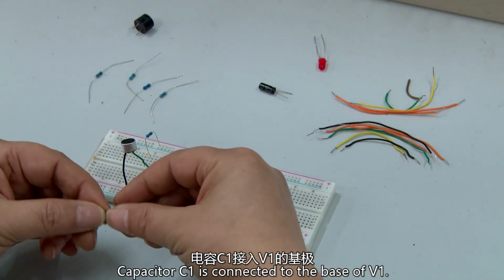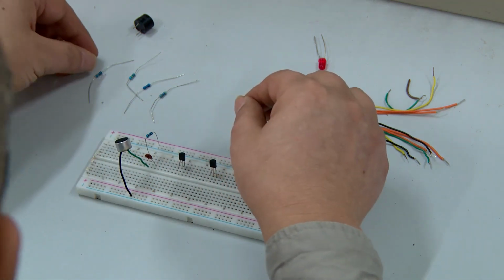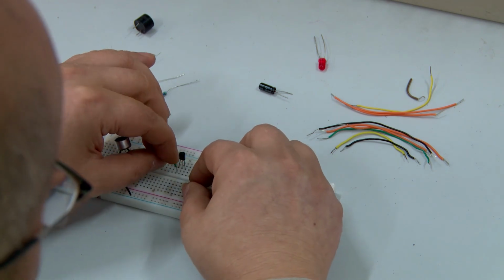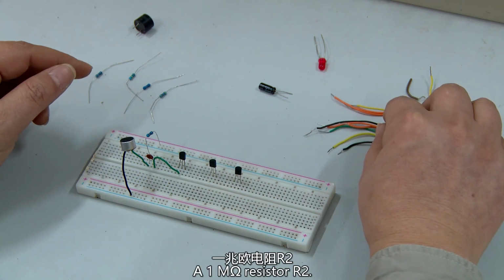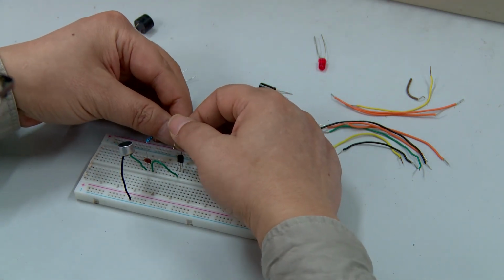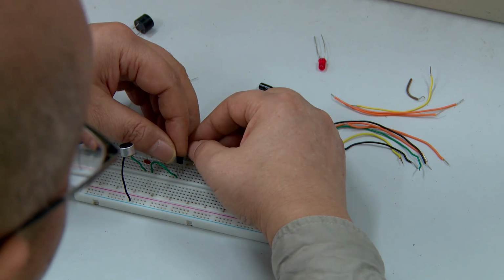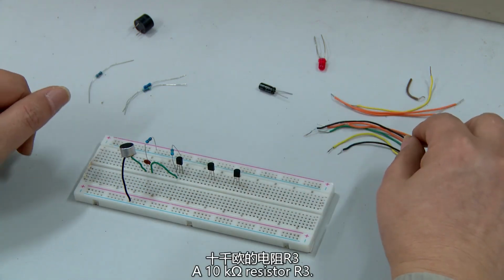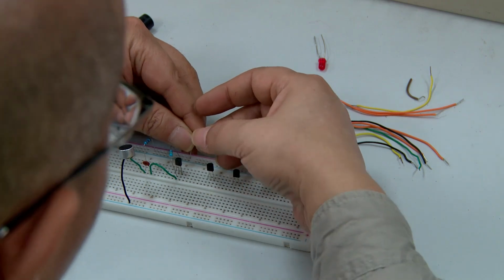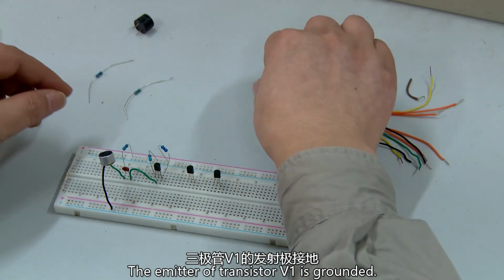Capacitor C1 is connected between the base of V1 and the connection point of R1 and the electric microphone MIC. A 1M resistor R2 is connected between the positive power supply and the base B1 of V1. A 10K resistor R3 is connected between the positive power supply and the collector C1 of V1. The emitter of transistor V1 is grounded.